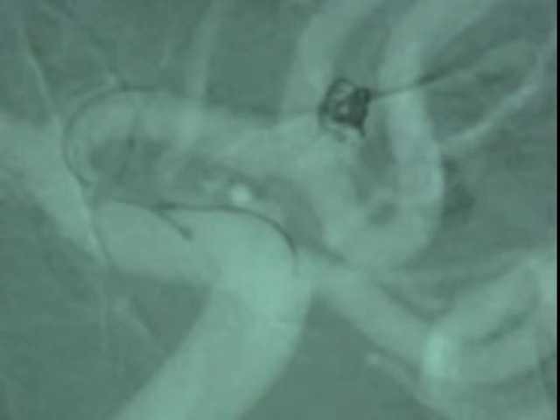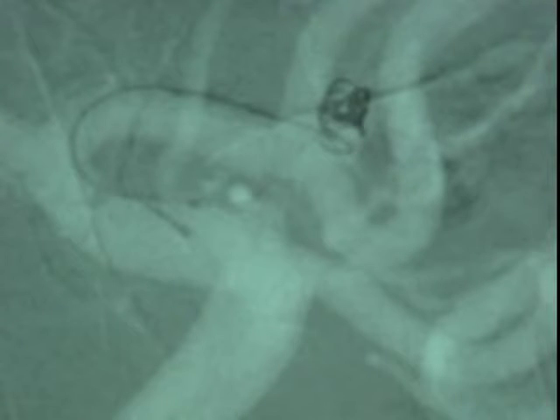This coil will be manipulated numerous times until it locks itself into place within the aneurysm and into the previously placed coils. This allows the coils to stay within the wide-necked aneurysm.